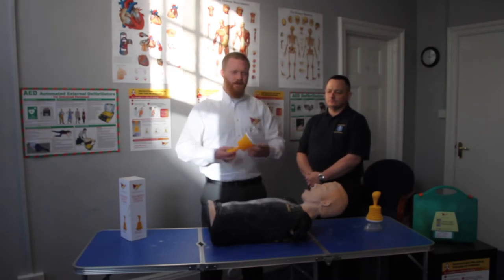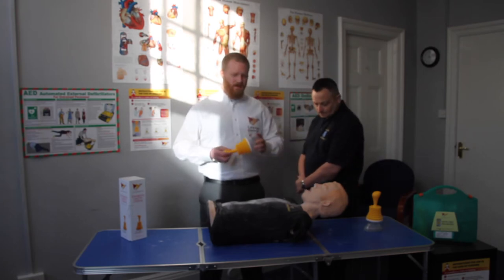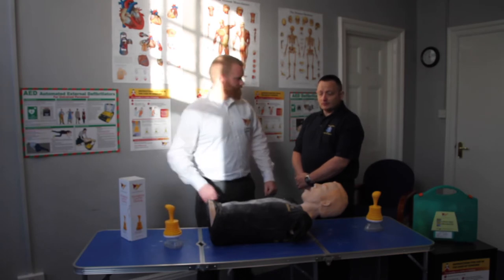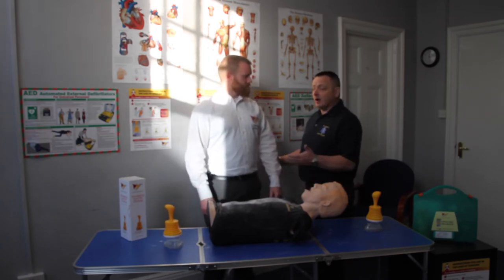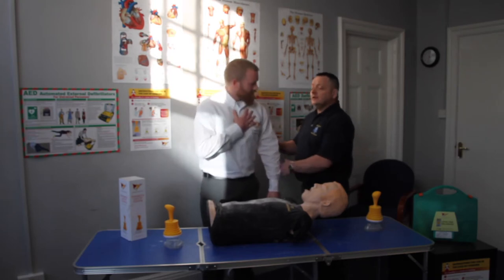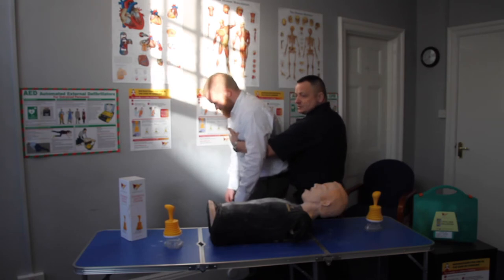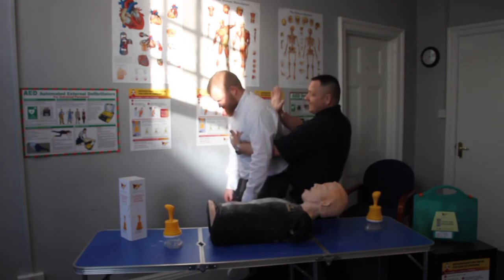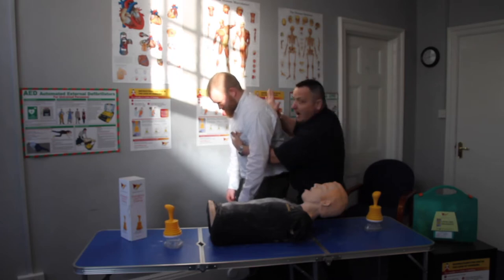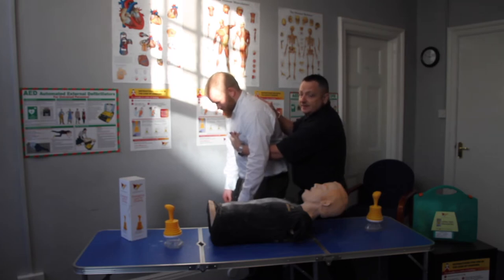We're now going through the choking BLS protocol with Keith, then I shall step in and show you how and when to use LIFEVAC. Recognising somebody's choking, ask the person to cough. I will then turn them around, make sure they're nice and safe, supporting their chest, and with the other hand delivering firm back blows between the shoulder blades — up to five times — checking after each one to see if the obstruction has been cleared.